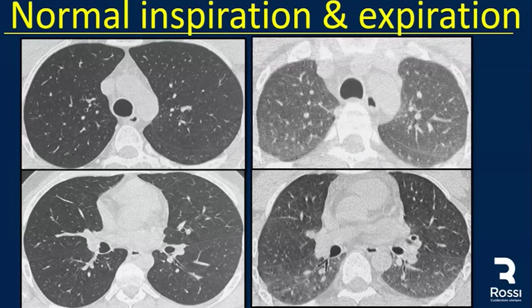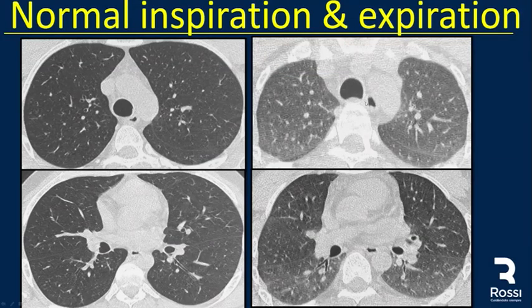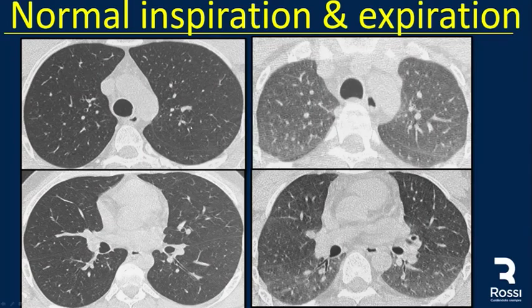This is a normal inspiratory CT where we see a rounded trachea. In an expiratory CT, we see the flattened posterior membrane of the trachea. When we perform an inspiratory CT, we see homogeneous lung. And when there is no air trapping, we see the same thing in the expiratory CT.